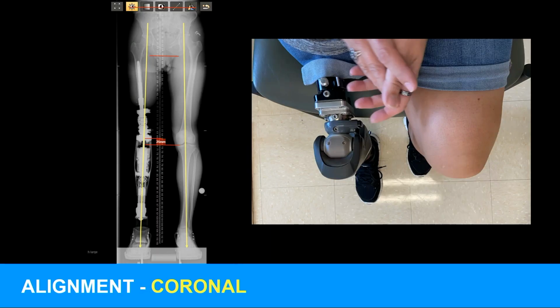There are many benefits to eliminating a socket, we know that. But two of the ones that make me the happiest probably is control. The femur, the skeletal stability is as good as it gets. And I've spent 40 years trying to stabilize bony anatomy within sockets.